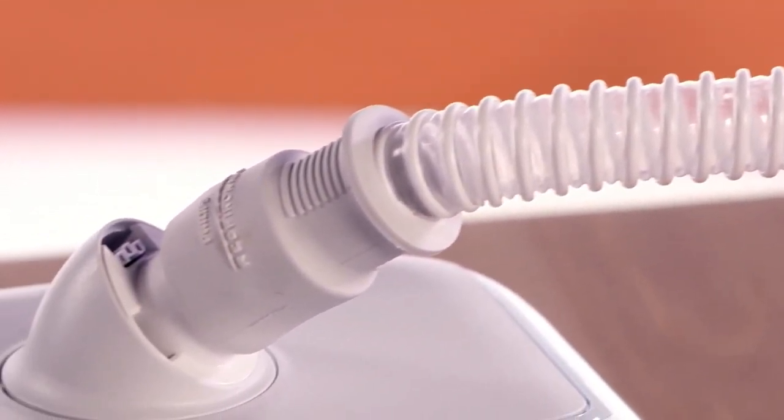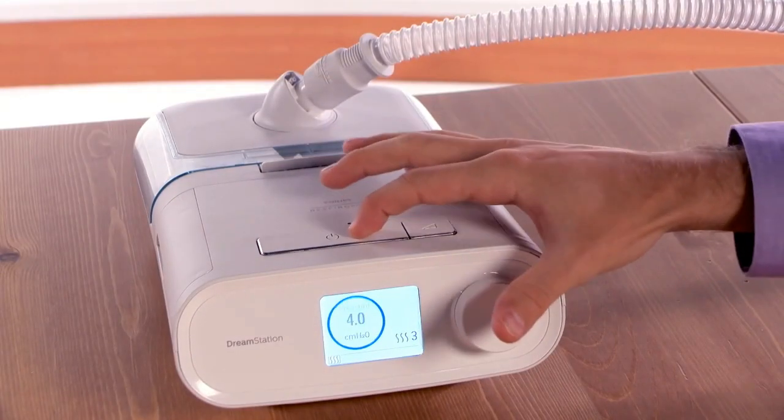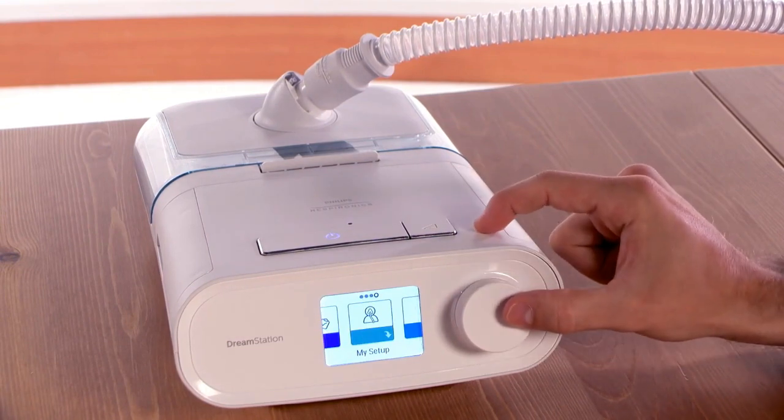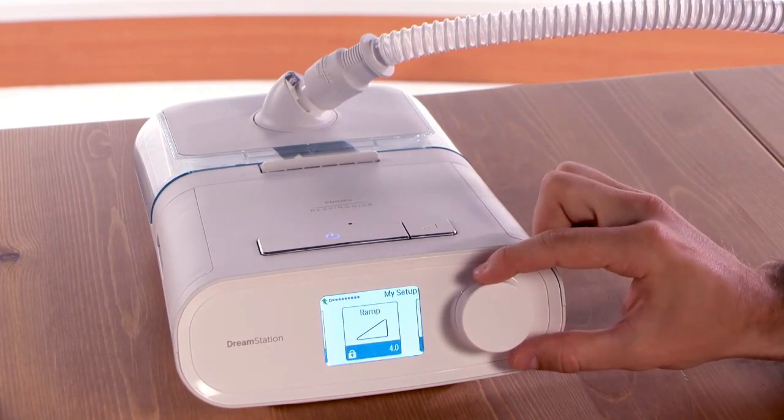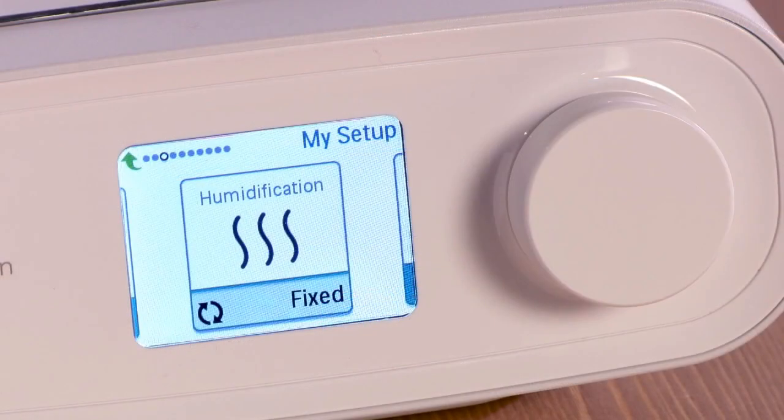If you are using a standard 15 or 22 mm tube, you have the option of fixed or adaptive humidification. With the blower turned off, rotate the dial to the My Setup menu and press the dial. Rotate to the humidification screen, where you will make your selection. Fixed Humidification Mode applies constant heat to the humidifier heater plate regardless of the conditions in your room. Adaptive Humidification Mode automatically adjusts the humidifier heater plate temperature to maintain a constant level of relative humidity to your mask.